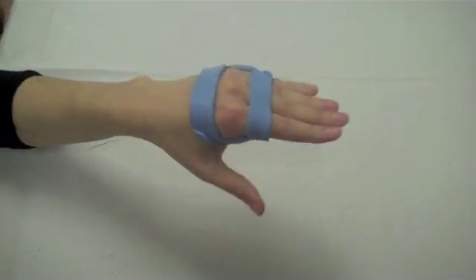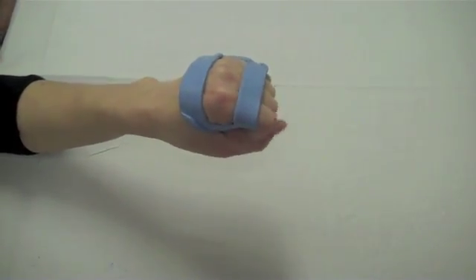Instruct the patient to make a fist, thereby ensuring that they have increased functional use of their hands.